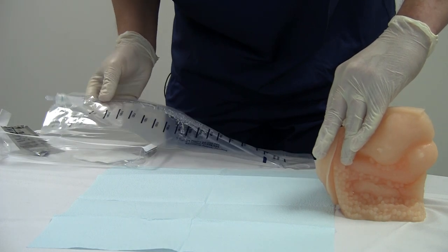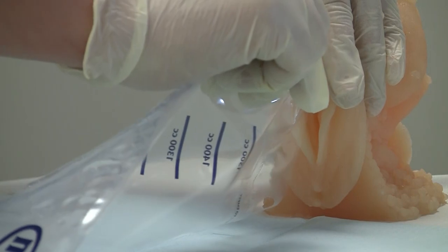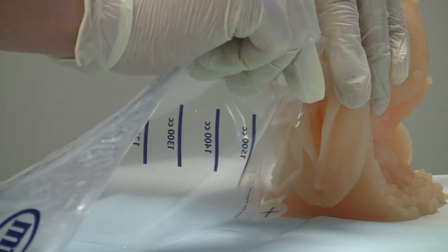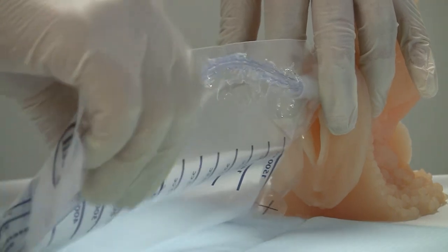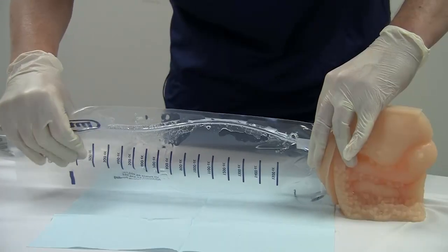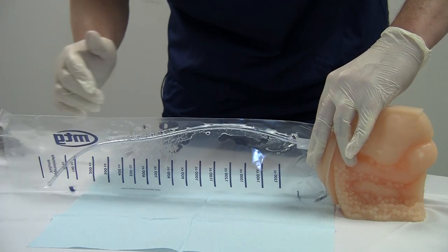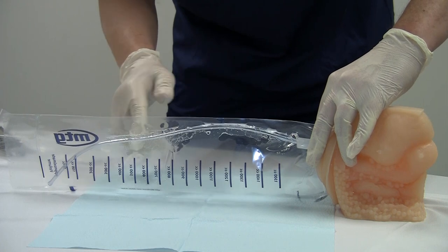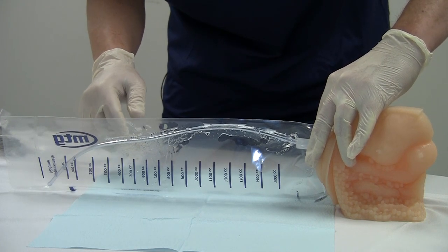Now take the catheter at the 1400 cc mark and insert the catheter and the introducer tip in the urethra, just as I'm doing here, okay? And use those two fingers to keep everything stable. Now notice here that I'm straightening the bag. I want to make sure that the bag is parallel with the legs with the MTG logo up. Reason being that once she starts to void, I want the urine to go down into the bag and I want to be able to see the urine flow.